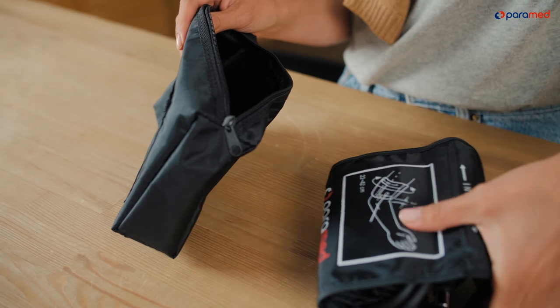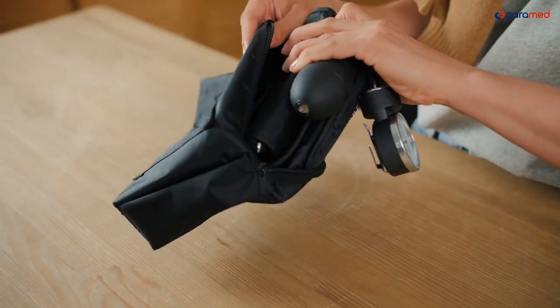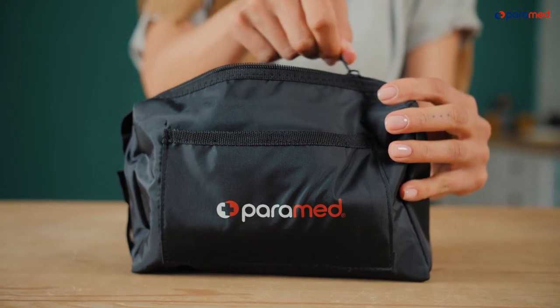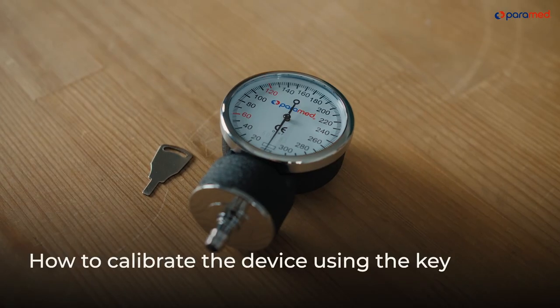After using the device, you should return it to the case — it will always be ready for use. We recommend writing down your measurements, which will help you and your doctor analyze your health.